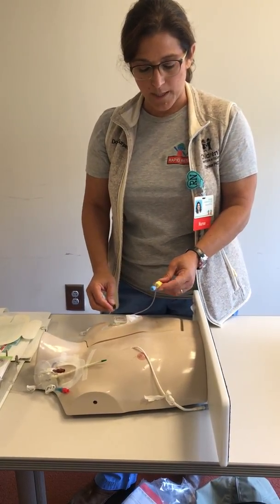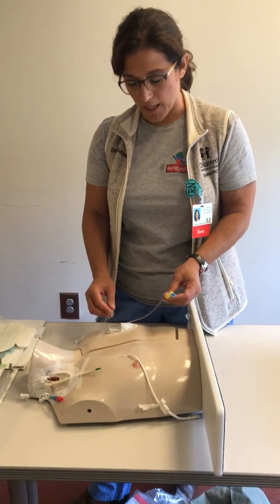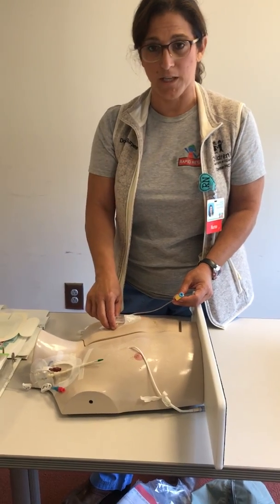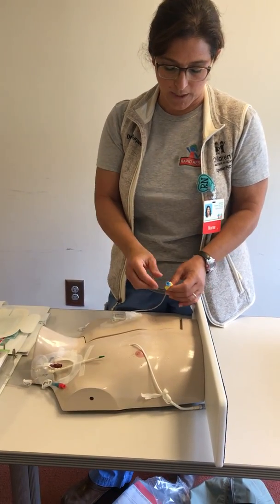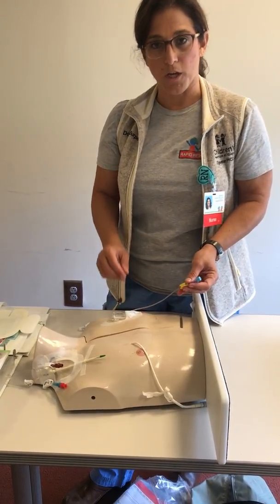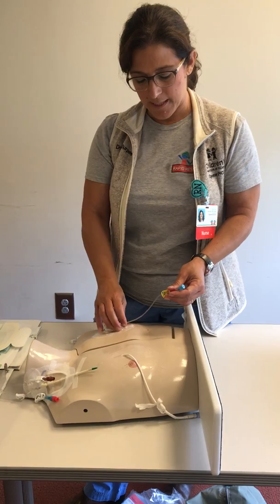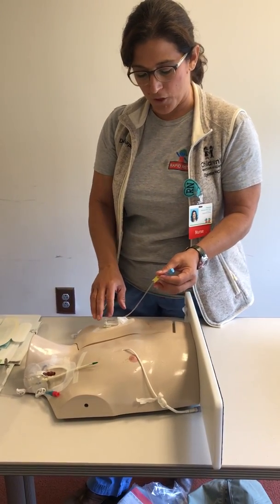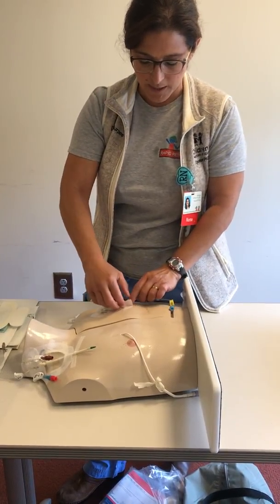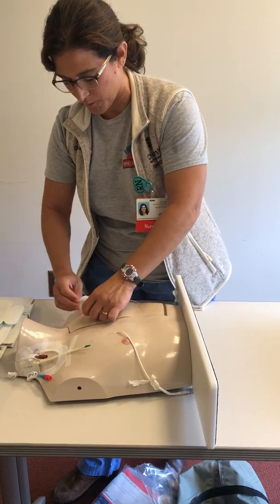The important thing to remember is that if you are de-accessing a port, you have to put heparin in the line before you de-access it. We would hate to de-access the port and have it clot off, and then they'd have to go back to surgery and get a new port. So make sure you put a heparin lock in there. We like to use 100 units per ml, 5 mLs for our kids. Then you can de-access the port. So we're going to assume we put in the heparin, and we will de-access the port using gloves and all standard precautions.